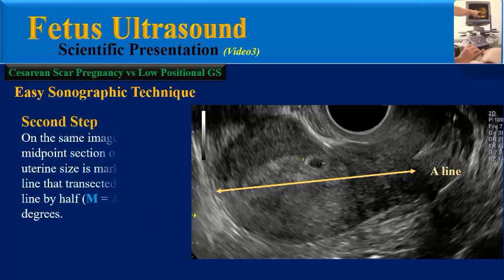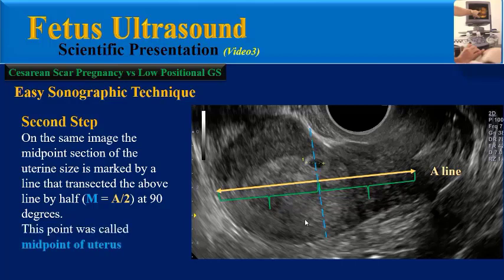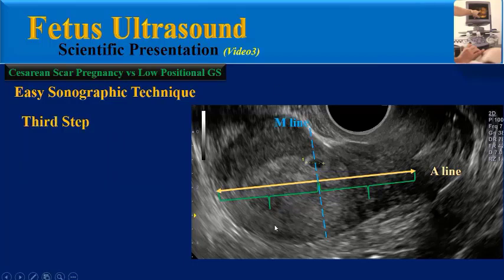In the second step, on the same image, the midpoint section of the uterine size is marked by a line that transects the A line by half at 90 degrees. This point is called the midpoint of the uterus, or M line.